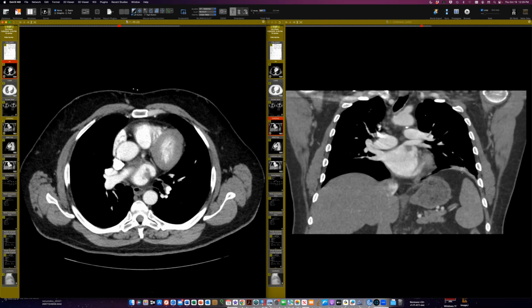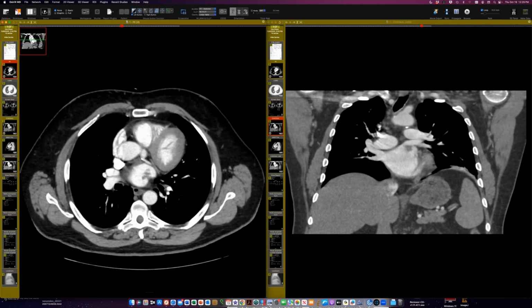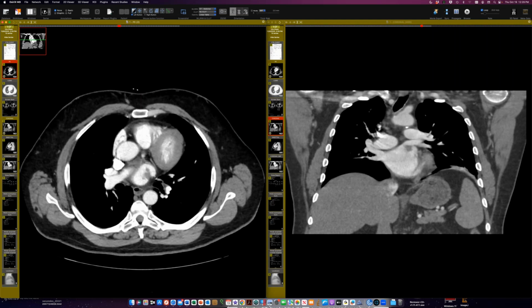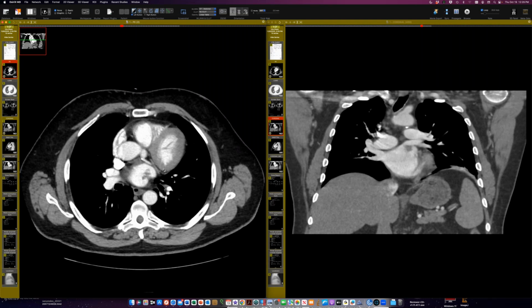This CT scan was done a few months after that acute episode, and it was done for PE, and there wasn't any PE. The guy is still short of breath and still has vague chest pain at this point. So when I saw something like this, I thought, did he embolize something? Did he have a transient occlusion of, say, a coronary artery, causing the left chest pain, and it subsequently resolved? I think it'd be good to follow this up with an echo.